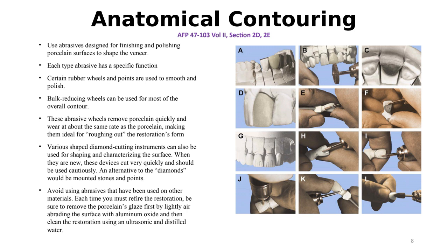For the thing, like you, before you're doing the characterization now, you just redefine your anatomy.